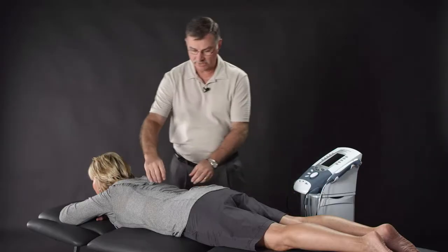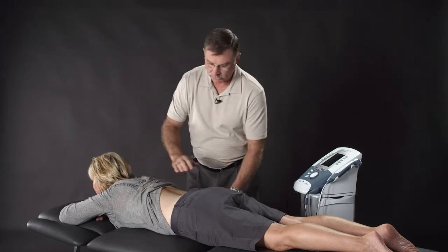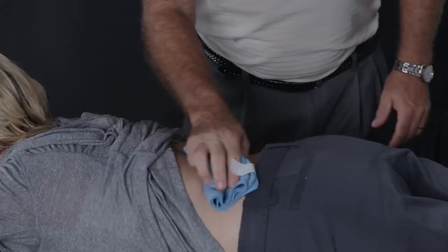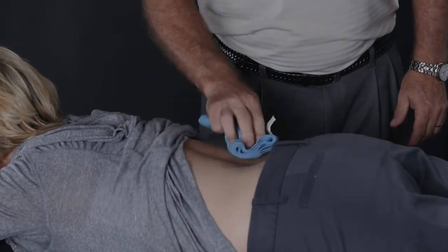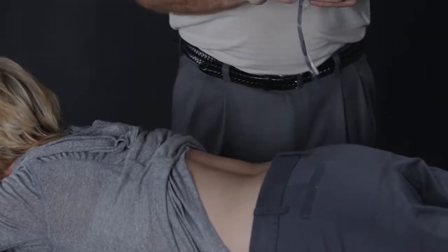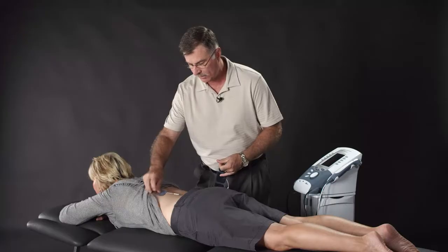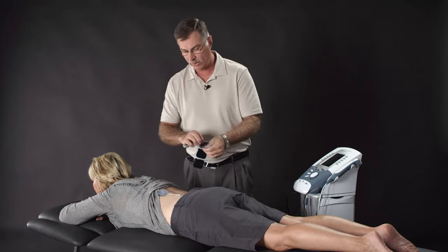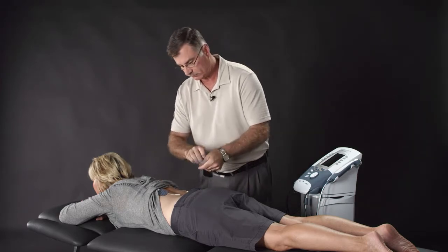Now, the first thing we'll need to do is prep the patient's skin. So we'll expose the back, we'll take a warm washcloth and we'll actually wipe the skin and prep the area to remove any excess oils or skin that's in the area. We will then place the electrodes on the skin. Remember, with interferential, we want to do this in a crossing pattern. So since we're treating the whole low back, we're going to put 4 electrodes on the patient.